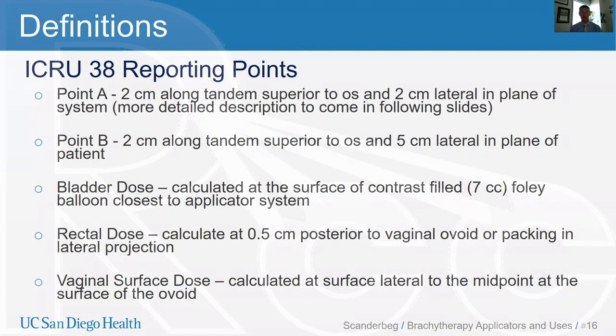This geometrical point is supposed to represent the location where the uterine vessels cross the ureters, and it's the tolerance of this area that was thought to be the dose-limiting factor in radiation therapy for the cervix-uterus complex. Now with 3D imaging, we can better visualize patient anatomy, but with decades of clinical data behind us, we still use point A as our prescription point, and then adjust depending on individual anatomy and our DVH metrics. I'll describe the exact way of finding point A on the next slide, as presented by the American Brachytherapy Society.